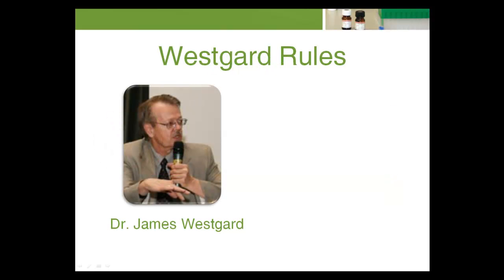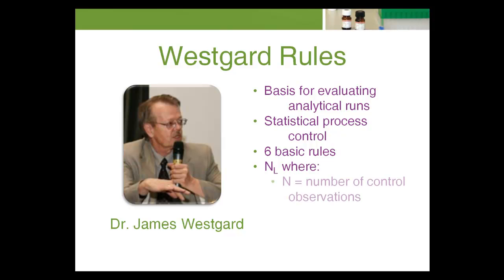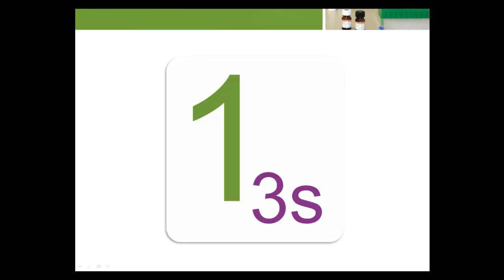In 1981, Dr. James Westgard of the University of Wisconsin published an article on laboratory quality control that set the basis for evaluating analytical run quality for medical laboratories. The elements of the Westgard system are based on principles of statistical process control used in industry nationwide since the 1950s. There are six basic rules in the Westgard scheme. These rules are used individually or in combination to evaluate the quality of analytical runs. Westgard devised a shorthand notation for expressing quality control rules. Most rules can be expressed as NL, where N represents the number of control observations to be evaluated and L represents the statistical limit. Thus, 1-3s represents a control rule violated when one control observation exceeds the positive-negative 3s control limits.